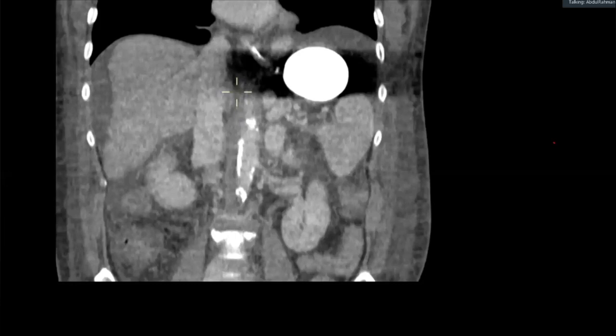If they have varices, ascites, chronic liver disease, and an enlarged spleen, what condition do they have? This is called what? A complication of cirrhosis. All of these come under one complication of cirrhosis. So this patient has portal hypertension, right? With all the features that you and I have found, the ascites, the varices, the splenomegaly. Let's just stick on this structure related to the varices. What is this?